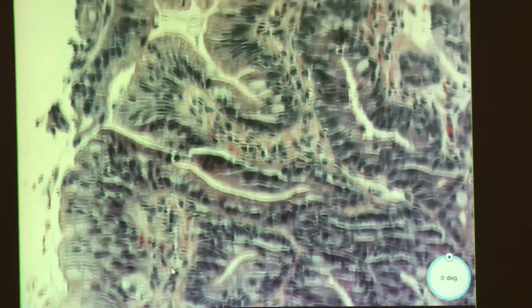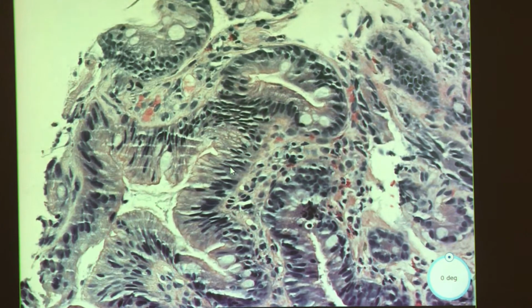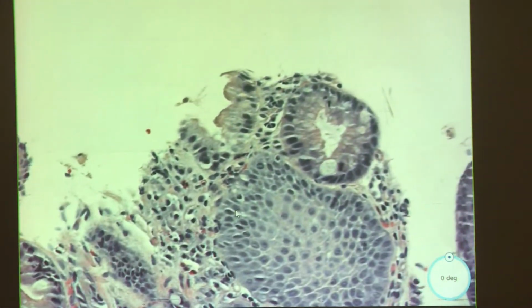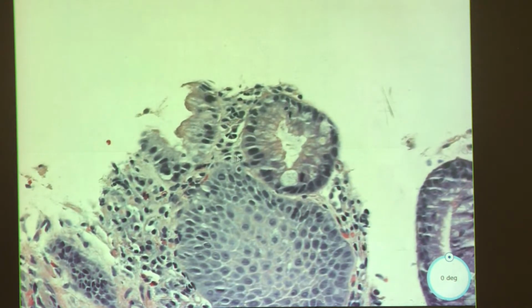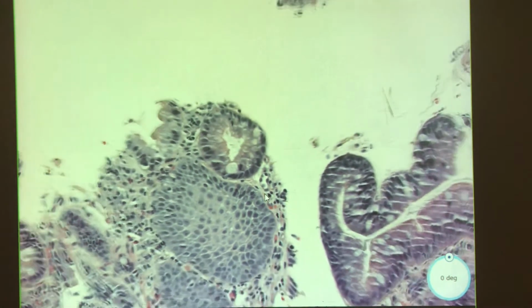I think you still need to look for dysplasia, but you also need to hold back a little bit when you start seeing inflammation. I mean, it's not too bad. This can be accounted for probably from inflammation, this degree of slight atypia. So I'm going to say no dysplasia.